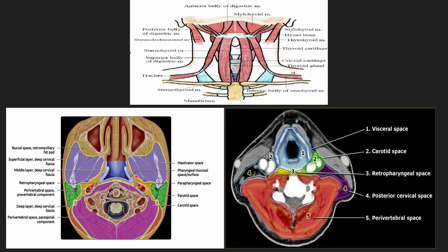Coming to a section below, we have the visceral space which is the continuation of the pharyngeal mucosal space. On both sides we have the carotid space, and posteriorly we have the perivertebral space. Between the perivertebral and the visceral space we have the retropharyngeal space. Between the perivertebral space and the sternocleidomastoid laterally, we have the posterior cervical space, which is better appreciated in this section.